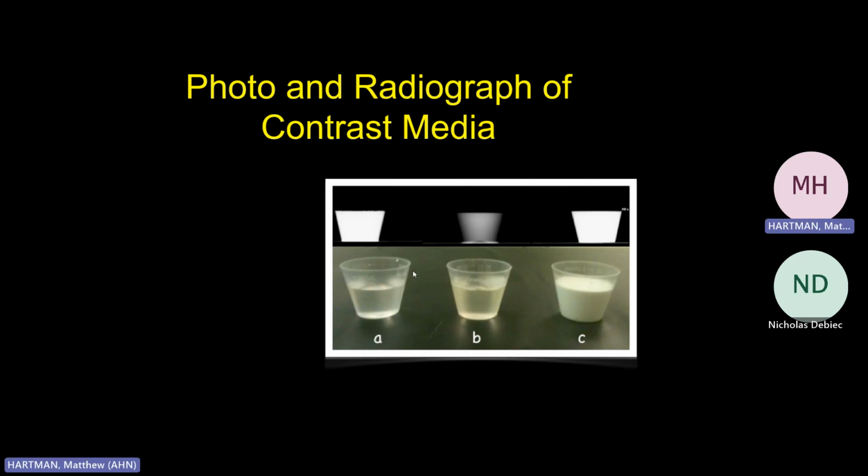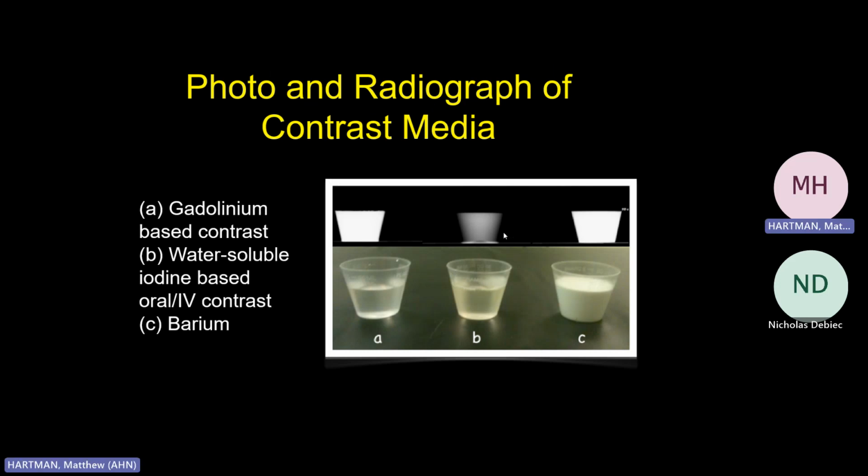So here are the 3 substances, gadolinium, iodine-based contrast, and barium. When we X-ray them, again, all radiopaque, and when you look at what they actually look like, one looks like milk, one looks like ginger ale, one looks like water. But the X-ray never lies, they're all radiopaque.